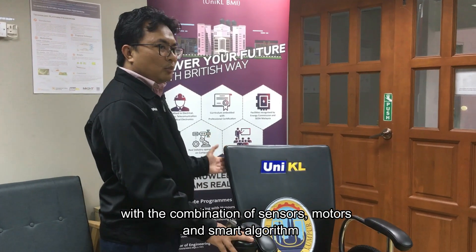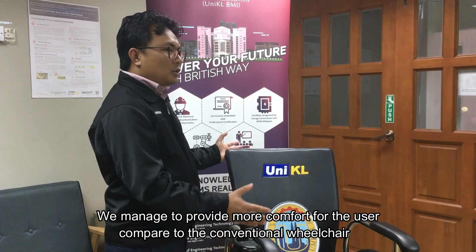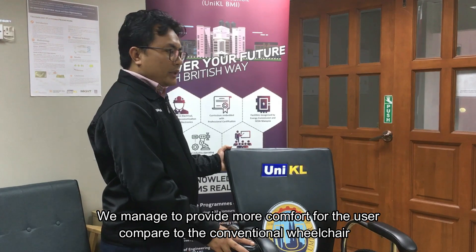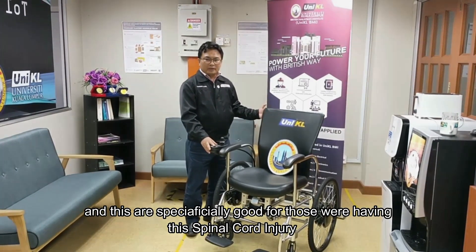With a combination of sensors, motors, actuators, and a smart algorithm, we managed to provide more comfort for the user compared to the conventional wheelchair. This is specifically beneficial for those who have spinal cord injuries.